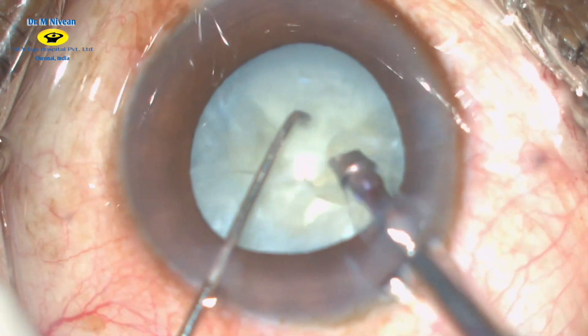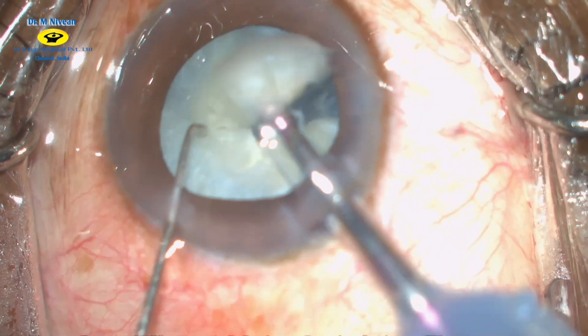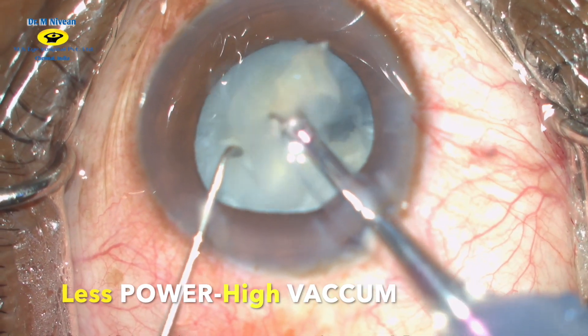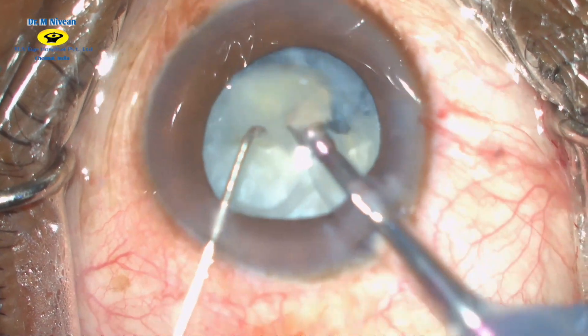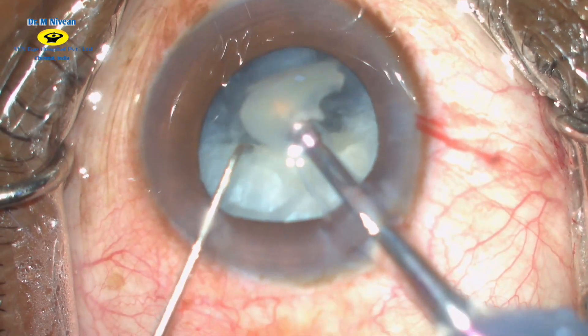Each quadrant is brought into the pupillary plane using very low phaco power and high vacuum, and the nuclear fragments are emulsified. With good fluidics, the anterior chamber is maintained.